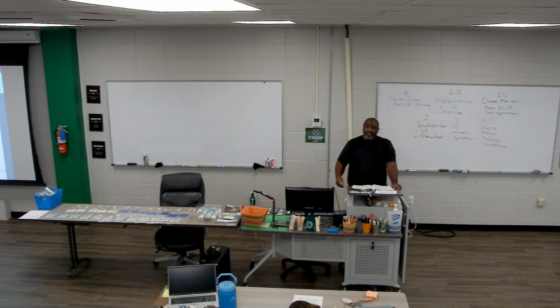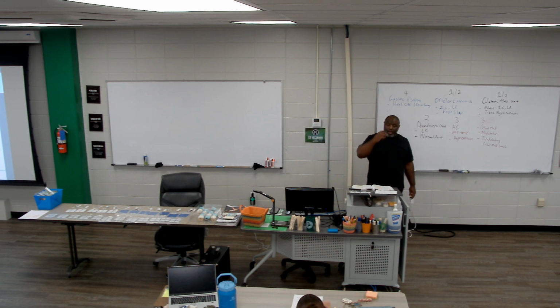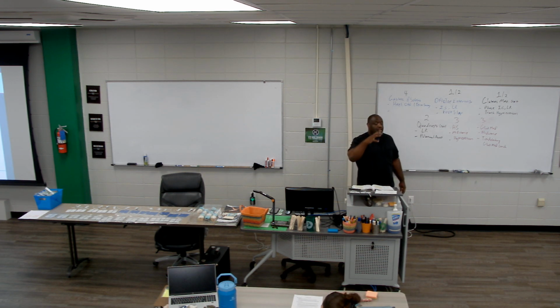So if I see that I'm not able to help my patient by using a certain frequency because it's not overcoming the barrier of the skin, I may want to increase my frequency so that I'm stimulating the right area at the right time.